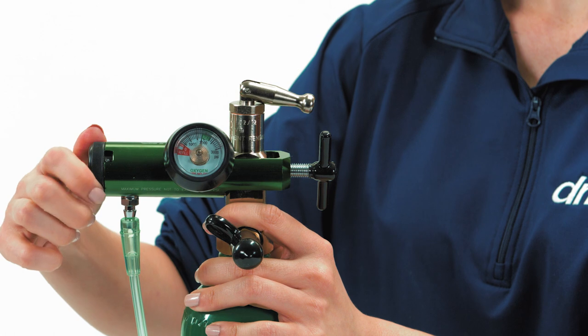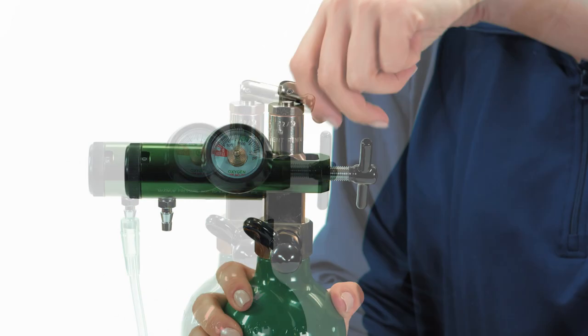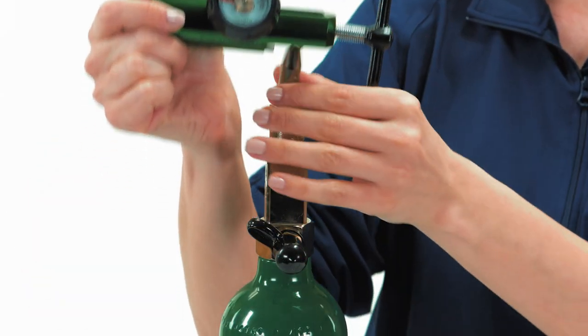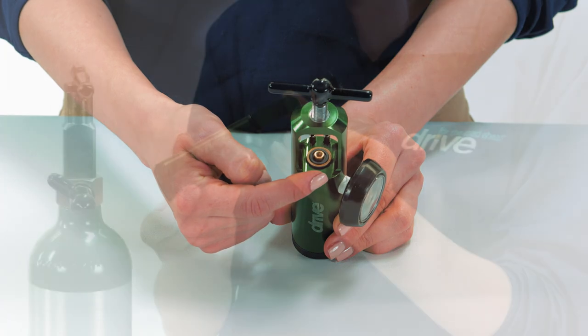If you hear a hissing sound, it is possible the seal washer is damaged or the regulator is improperly aligned on the cylinder. Turn off the cylinder by turning the valve clockwise. Remove the regulator and inspect the seal washer. If it is missing or damaged, contact your equipment provider for a replacement.